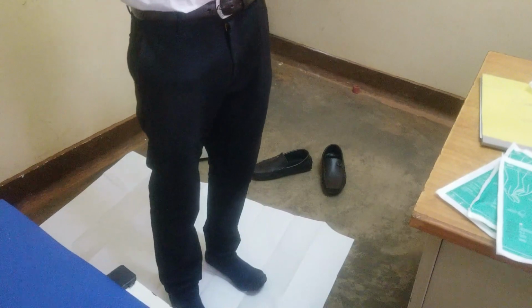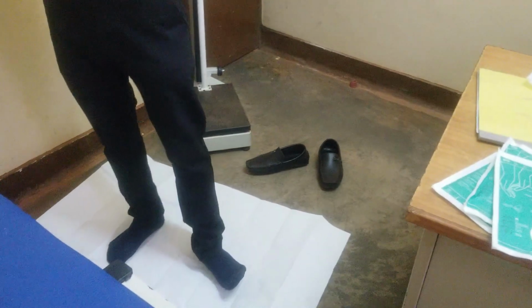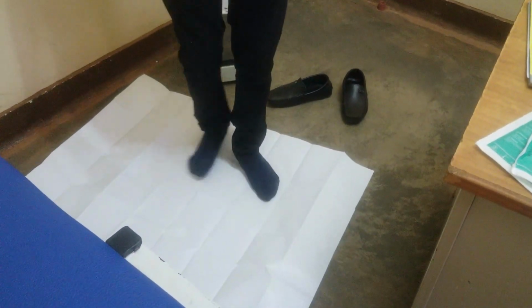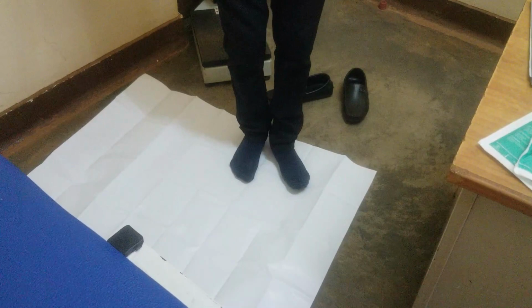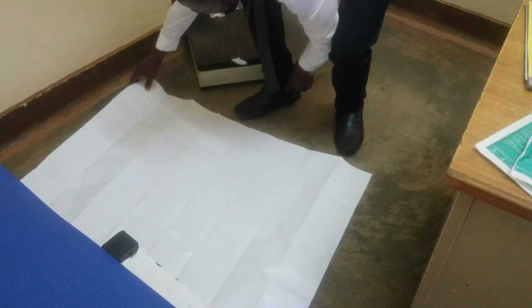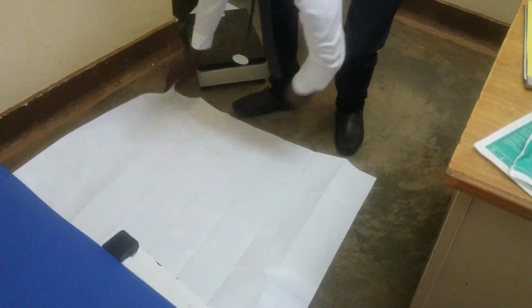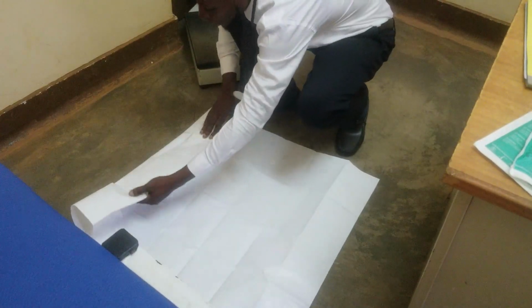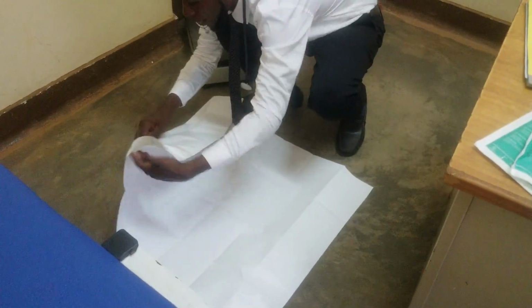He or she can undress and again jump on it. So after jumping on it, even if I see nothing that has fallen on it, I just fold it back slowly. I fold it back. I make sure I don't lose anything.